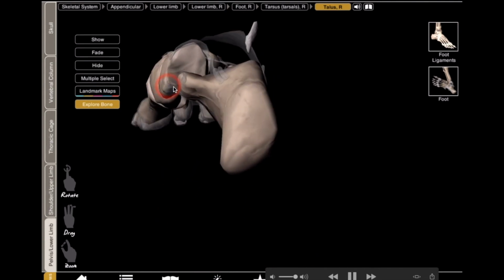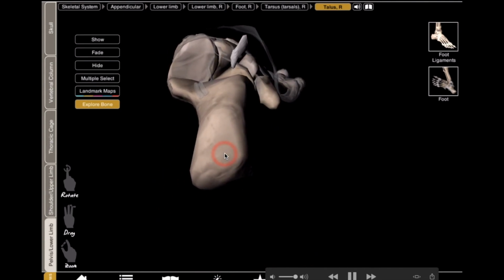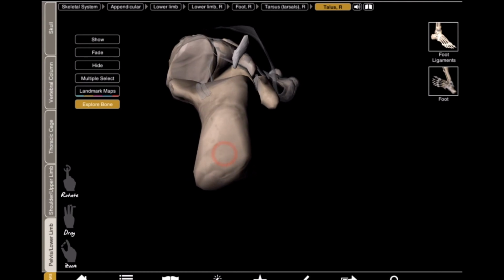So right now, what we take into consideration by the classification is the Sanders classification. In the Sanders classification, what we see is based on the coronal images. So we see this image, we shift it a bit up, and we see this portion. What we can see is this cross section, and what we take into consideration is the broadest part of the talus. The calcaneum just below it is responsible, probably because of the weight-bearing axis of the talus, for the fragmentation that actually takes place.